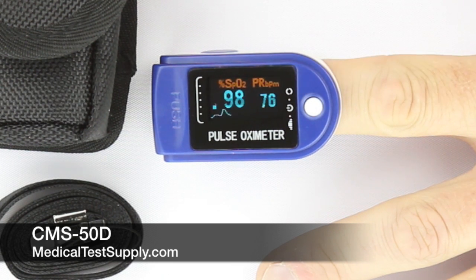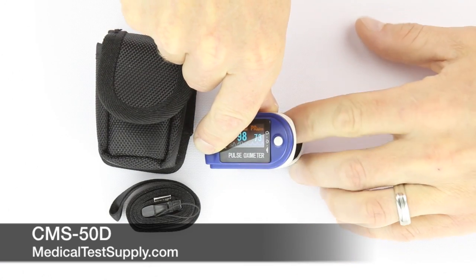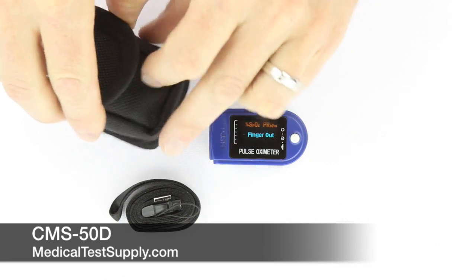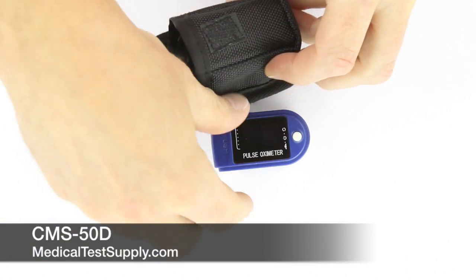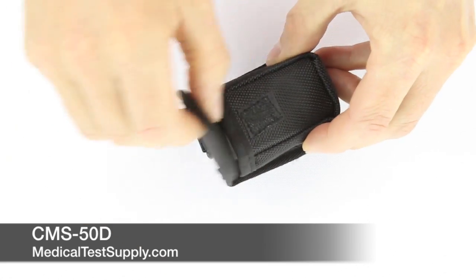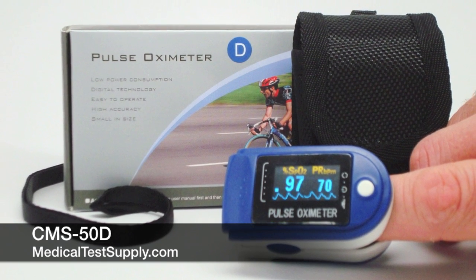As illustrated here, the oximeter also features an auto-off function that ensures the device will be off when not in use. The product is provided with a case and lanyard for safe storage and easy carrying. The CMS-50D is a great product for physicians, healthcare providers, and anyone doing spot check oximetry and pulse rate readings.